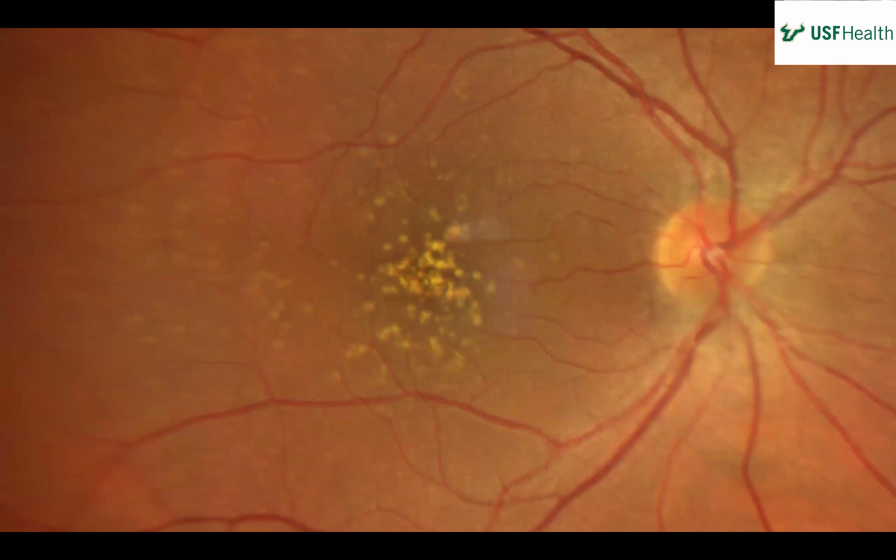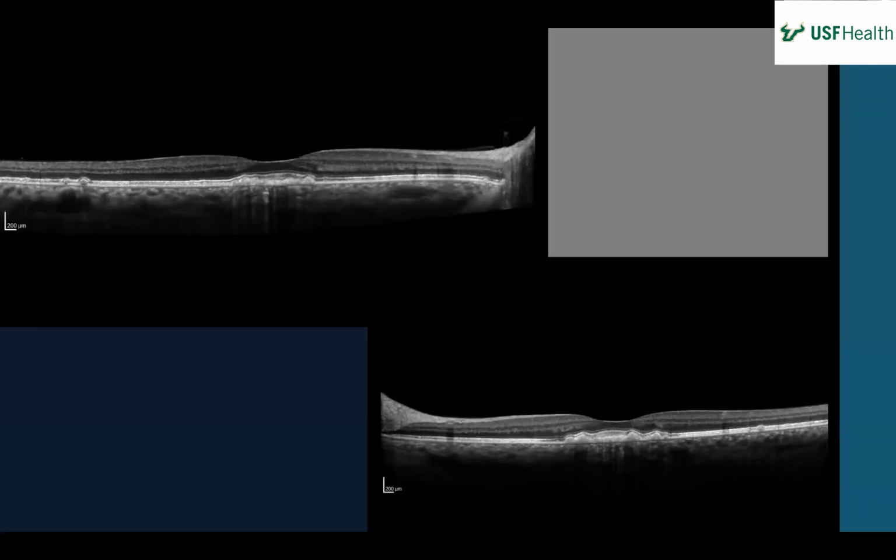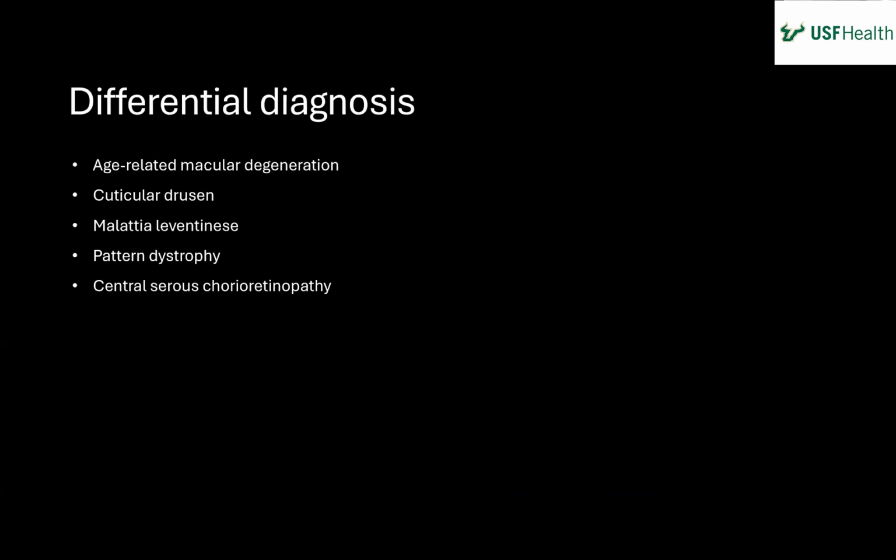And to talk about my differential, because these, I agree with Kim, could be thought to be hard exudates or focal intraretinal periarteriolar transudates. After seeing the OCT, I decided to make my differential more specific. So my differential included A and B. There it is. Yeah, Malattia, and then some other drusenoid dystrophies, particularly the Malattia Leventinese group, however you say the second word. And apparently in pachychoroid diseases, you can also develop something called pachydrusen, which, yeah, I have it in my charts, pachychoroid pigment epitheliopathy, and it's sort of like central serous without fluid.